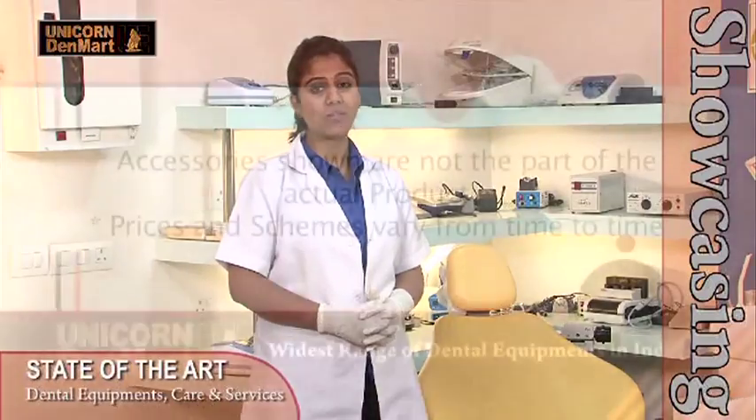All this makes this chair a highly affordable and comfortable experience for the patients in your clinics, and convenient for the users in the clinic as well.